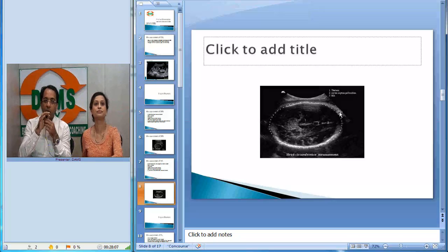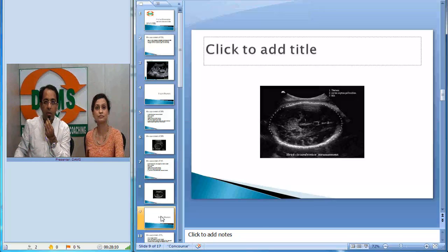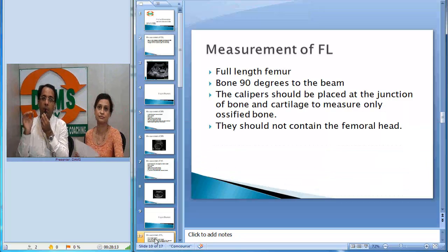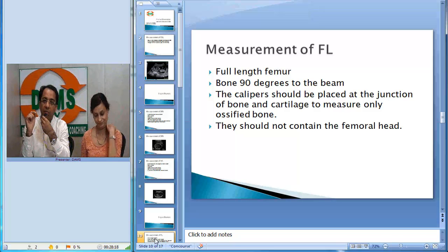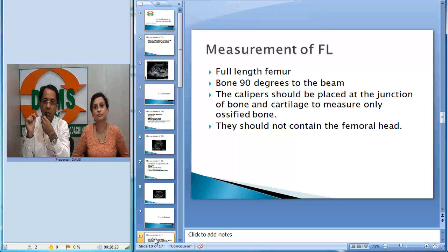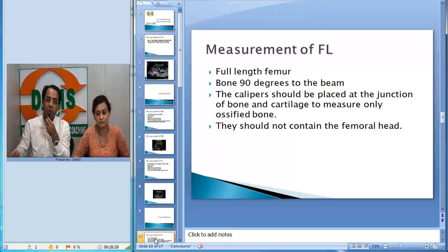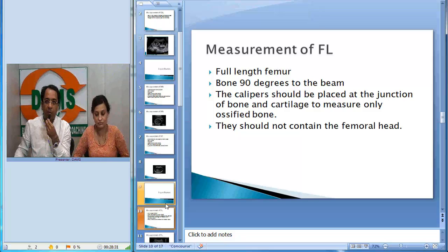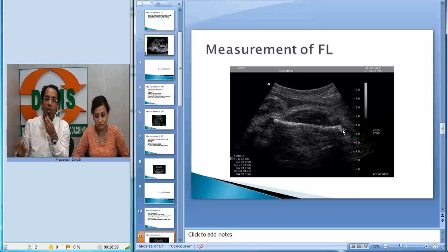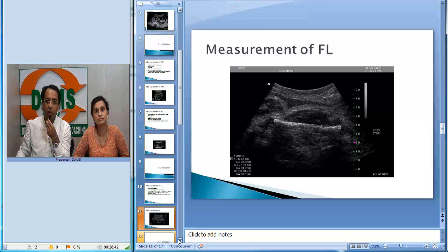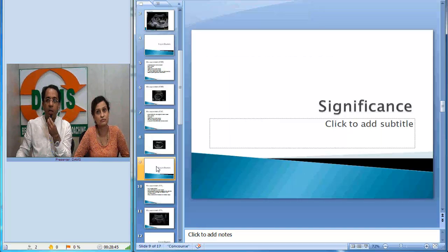The third fetal biometry parameter is femur length. You should see the full length of the femur in the measurement plane, with the bone perpendicular to the ultrasound beam. Calipers should be placed at the junction of bone and cartilage, measuring only the ossified bone, and should not include the femoral head. You measure from one end to the other, excluding the femoral head and cartilaginous part.